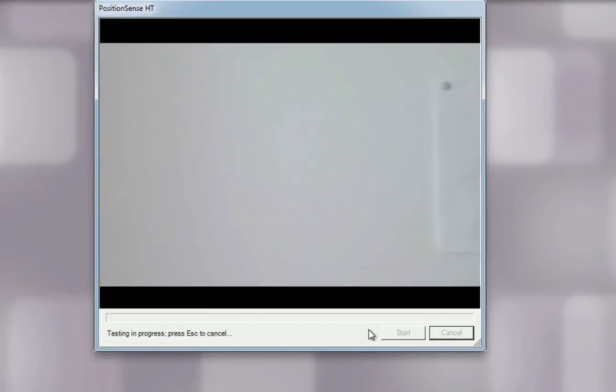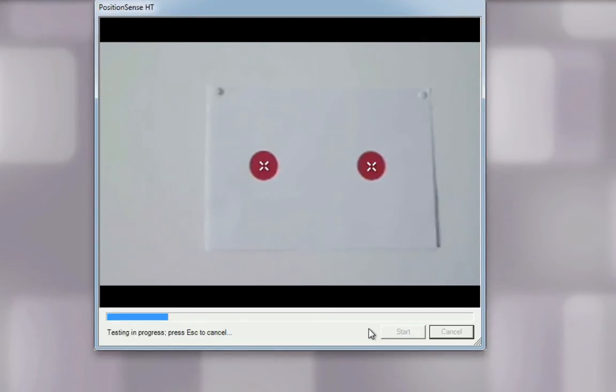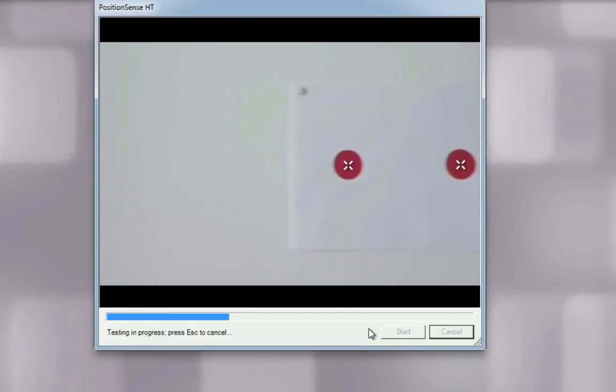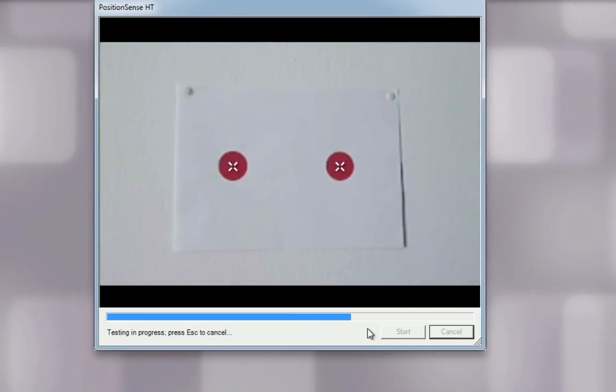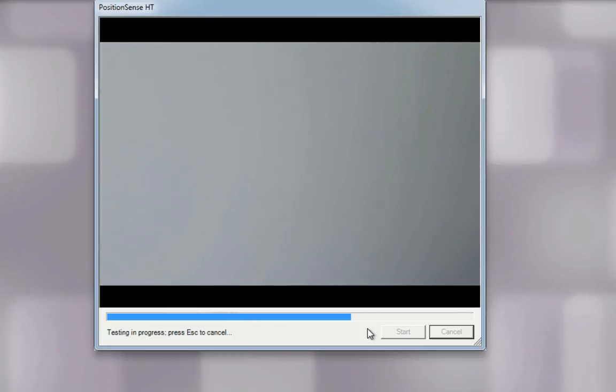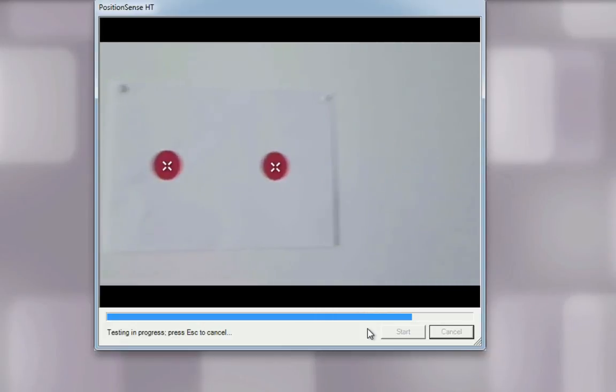Turn your head to the left, then return to center. Once you feel the patient has returned to a steady position, click the left mouse button. Repeat this movement two more times, clicking the left mouse button each time the patient returns to center. Then turn your head to the right, then return to center, clicking the left mouse button each time — repeat for three repetitions total.